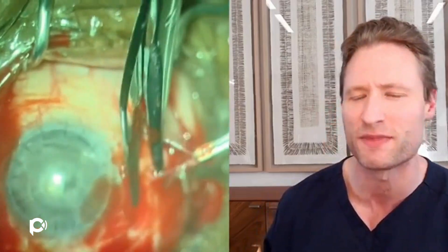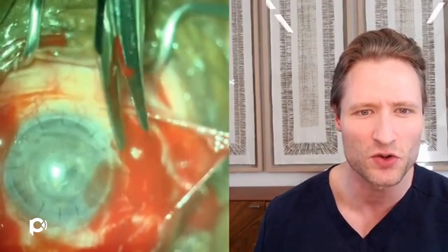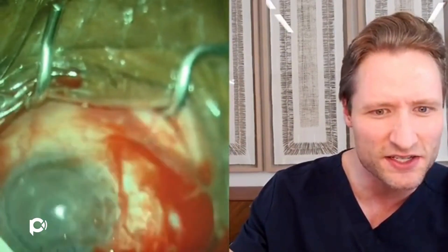This surgery was just performed two days ago. It is an anterior segment revision to remove the iris, remove the lens, perform a vitrectomy, and do a glued IOL. This starts with a peritomy made nasally and temporally. You'll notice all of the bleeding — this patient is on chronic anticoagulation. Even though he stopped his Coumadin two weeks previously, he still has this prodigious tendency towards extravasation. The conjunctiva is thin and friable and has been fused down to the scleral surface, so it's not easy to perform this peritomy.